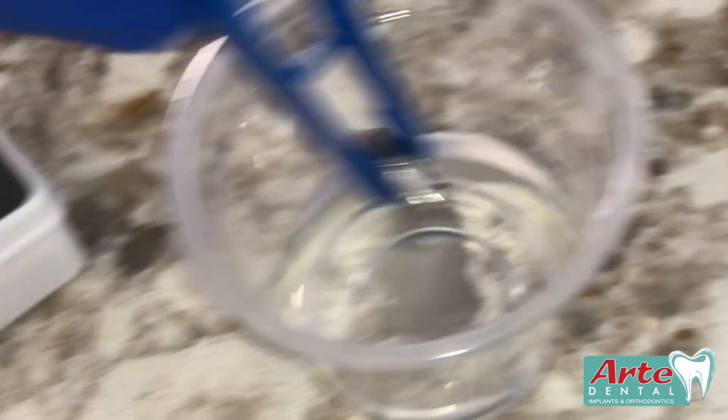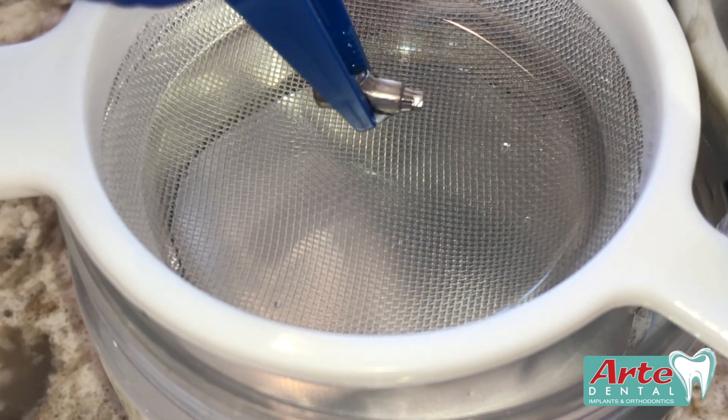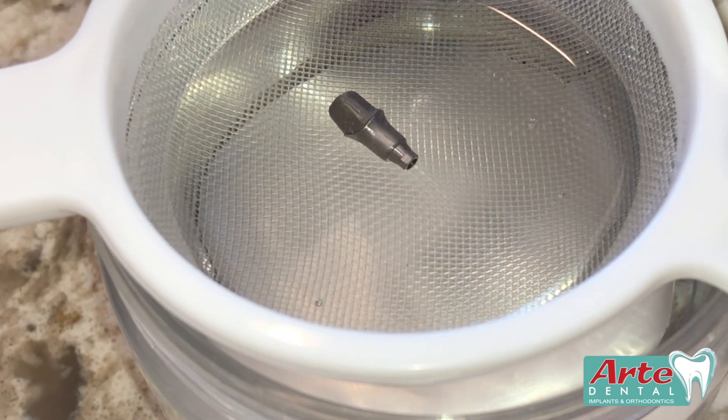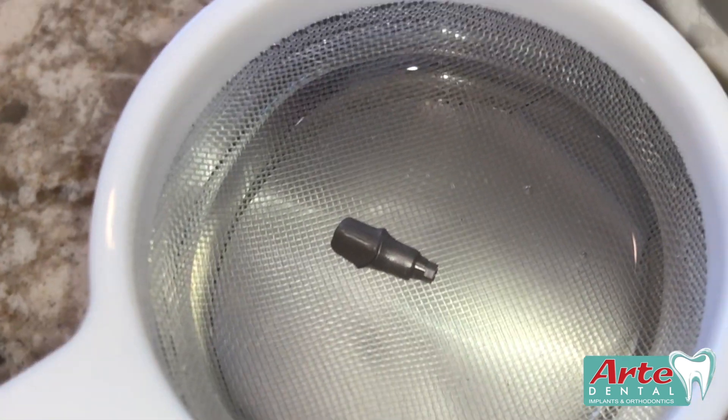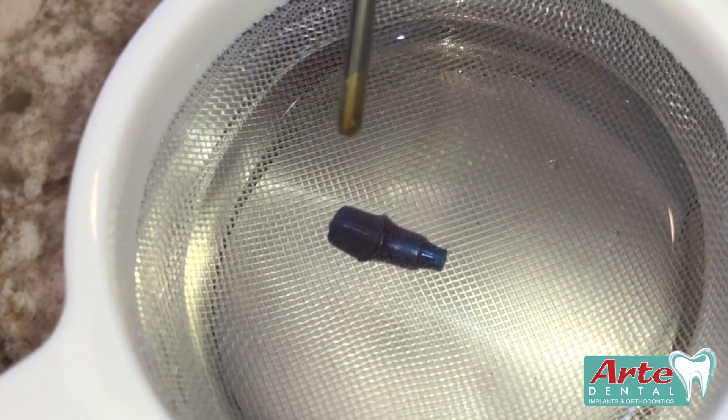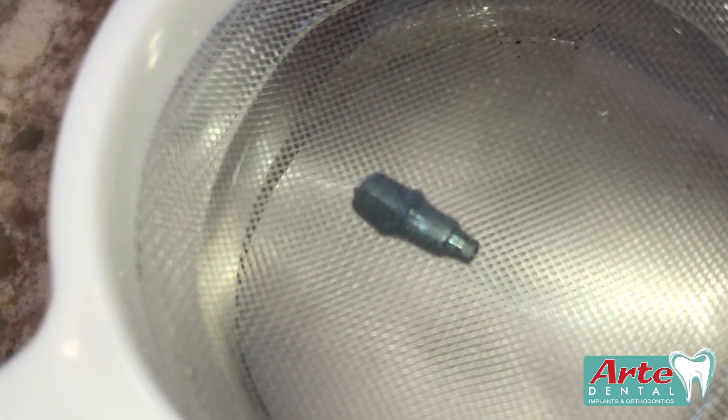So we're going to give it a quick bath in some distilled water and drop it into this anodizing tank here. Basically all we're going to do is prod this a couple of times with a rod and it's going to change from silver to blue.